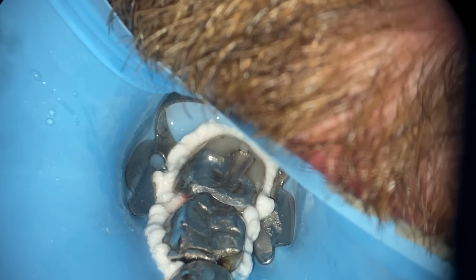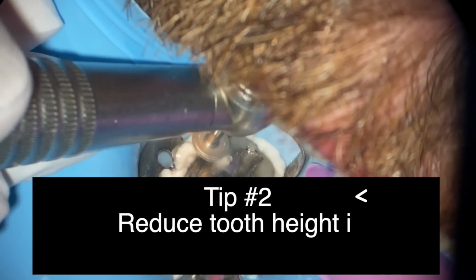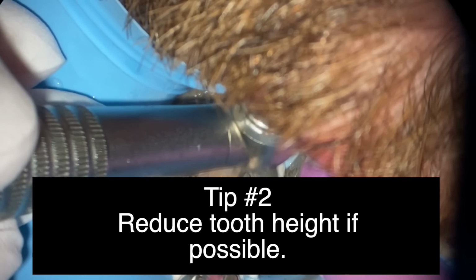The next tip I can tell you in helping to find canals, and just doing root canals in general, is make the tooth shorter. Now, you can't do that all the time, I get it, but we're going to replace both these restorations, and especially this posterior one. I'm reducing it out of the patient's bite for the next few months, because we're going to be placing calcium hydroxide. In the meantime, this one's serviceable, so we're good.